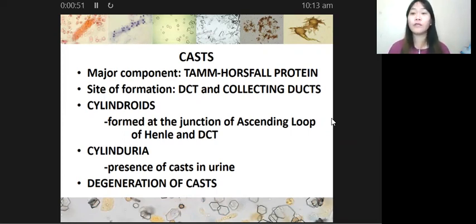So this is of course a continuation of our discussion on microscopic analysis. And for this video, I will be discussing casts. Okay, so let's start.